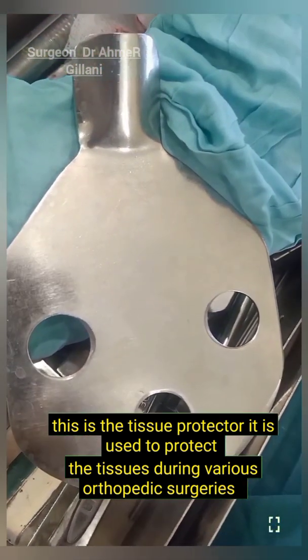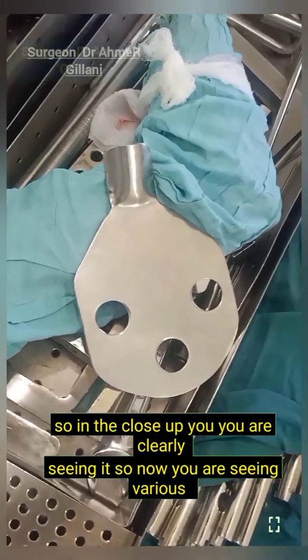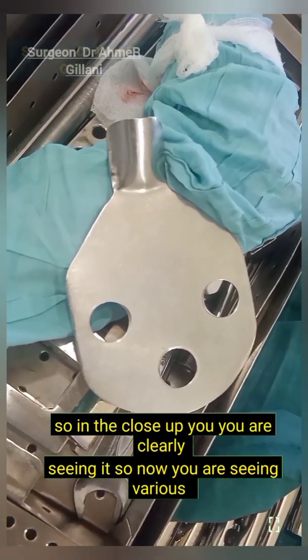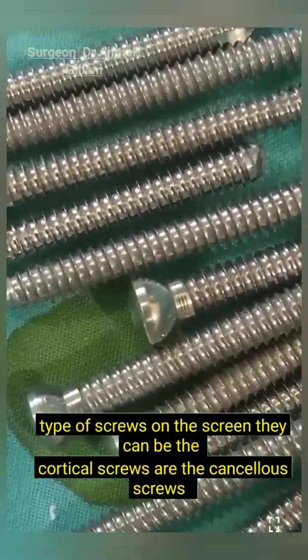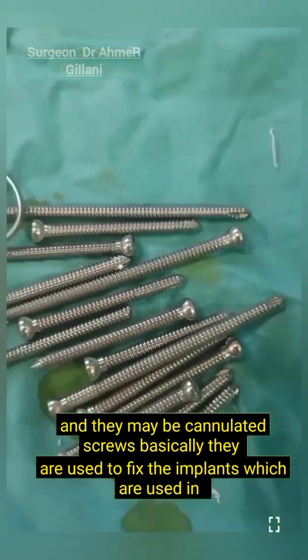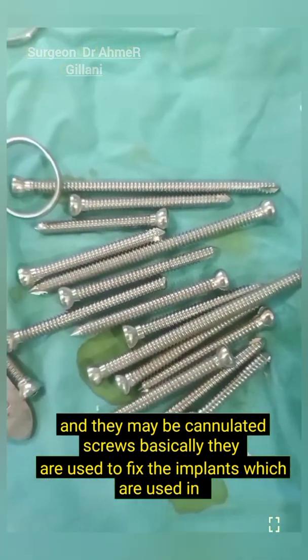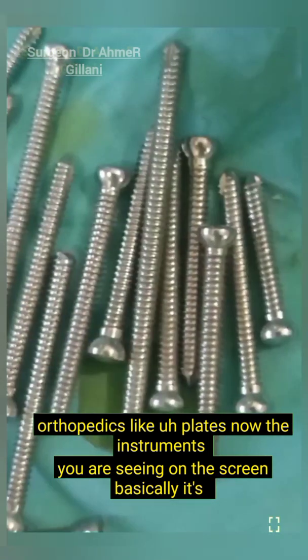This is the tissue protector. It is used to protect the tissues during various orthopedic surgeries. In close view you can clearly see it. Now you are seeing various types of screws on the screen — they can be cortical screws, cancellous screws, or cannulated screws. Basically they are used to fix the implants used in orthopedics, such as plates.